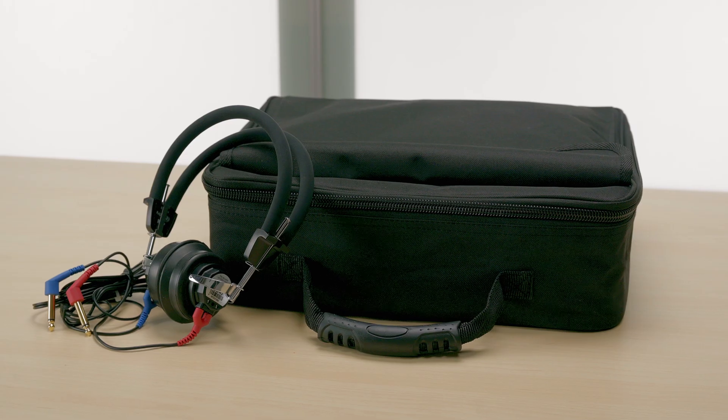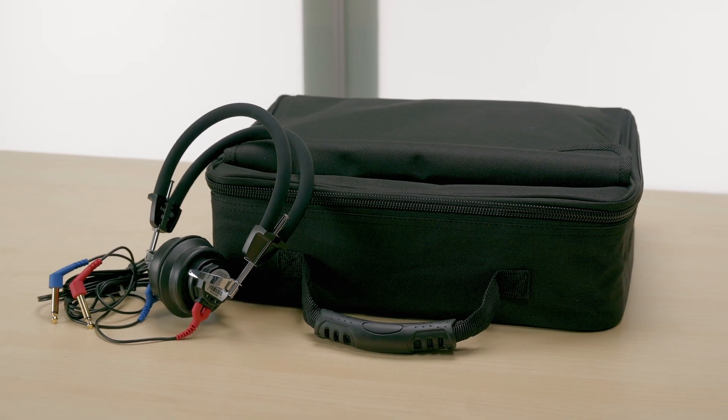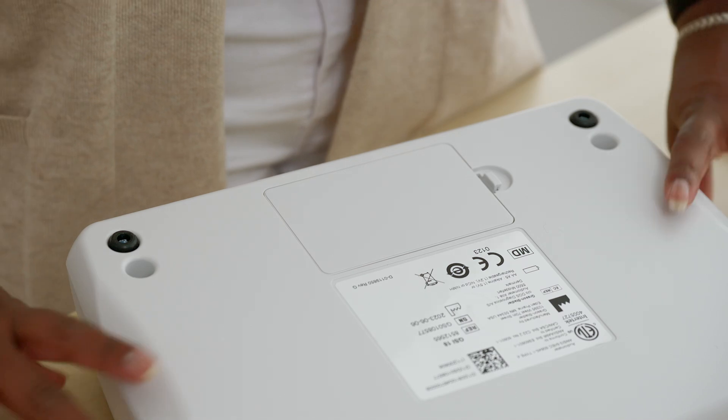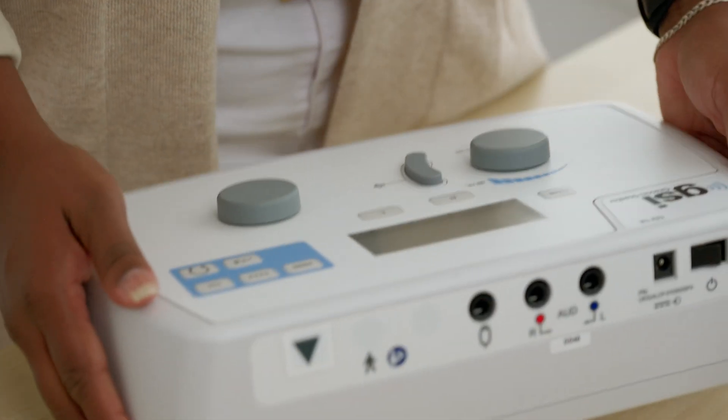The GSI 18 includes the audiometer, the over-the-ear headphones, and a custom-designed carrying case. A power cord is included; however, the GSI 18 may also operate using battery power when necessary. The battery compartment is located on the bottom of the instrument and holds five AA batteries, giving enough power for about 10 hours of testing. Audiogram forms and a quick guide for basic audiometry and test interpretation are also included.